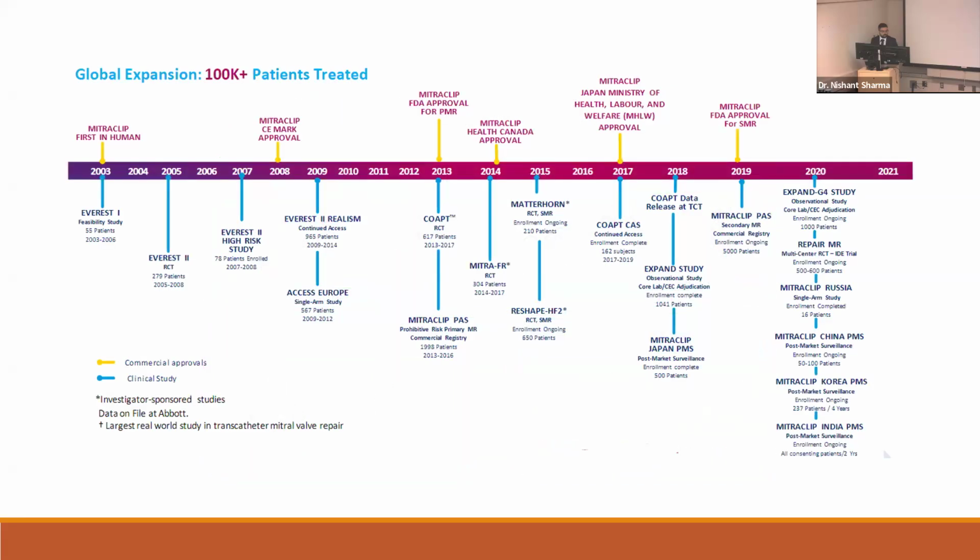So obviously, this is not a journal club. We're not going to go through every trial. What I will highlight is that there's been over 20 years of good data, at least earlier on. The trials really prove the efficacy and safety of MitraClip devices. And more recently with registry data, we really have good evidence for hard outcomes such as mortality and heart failure admissions.